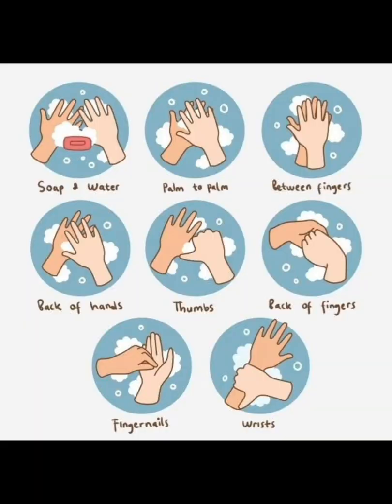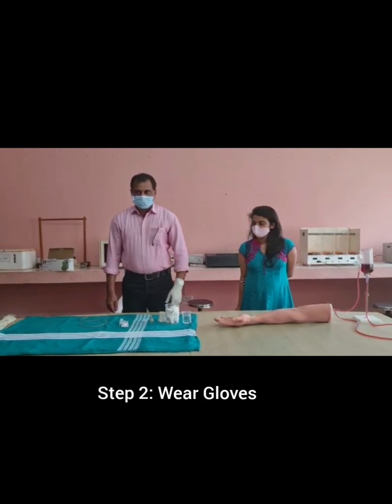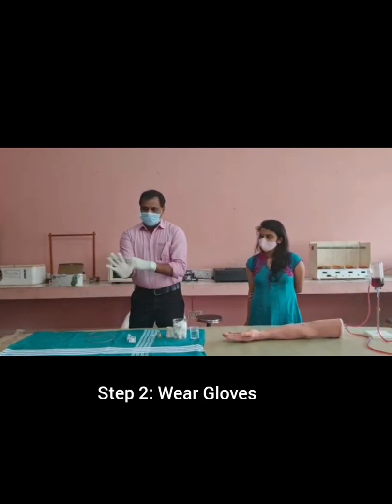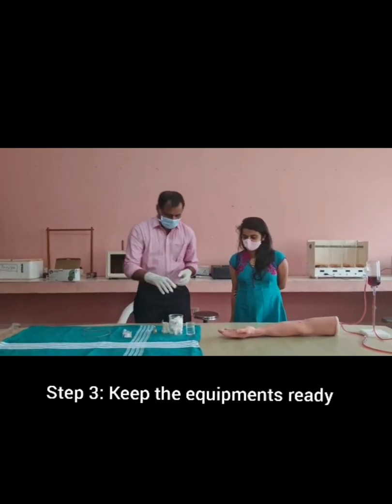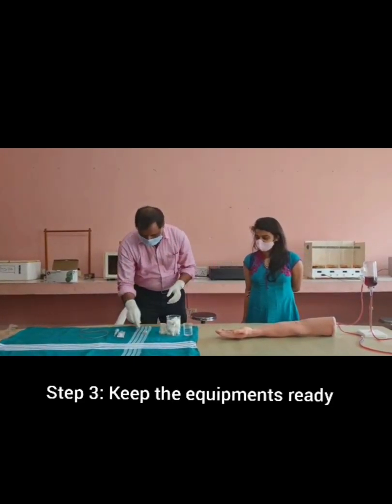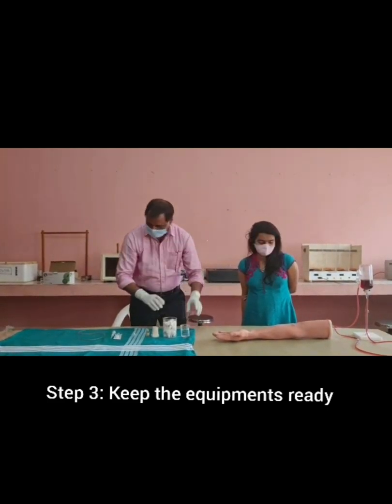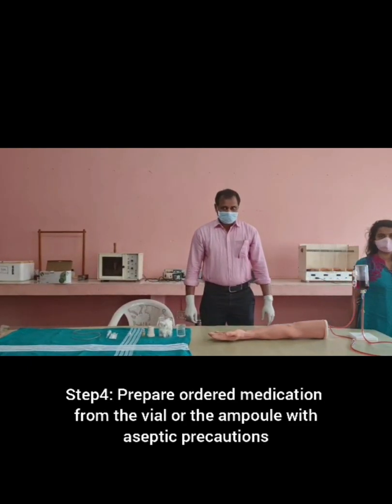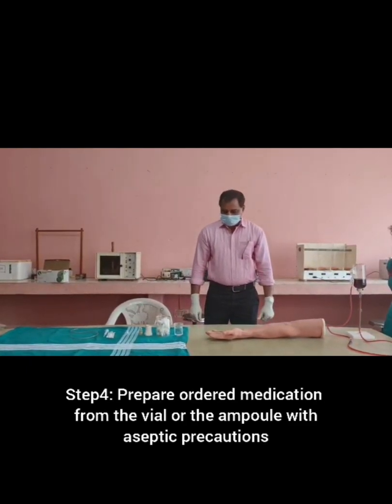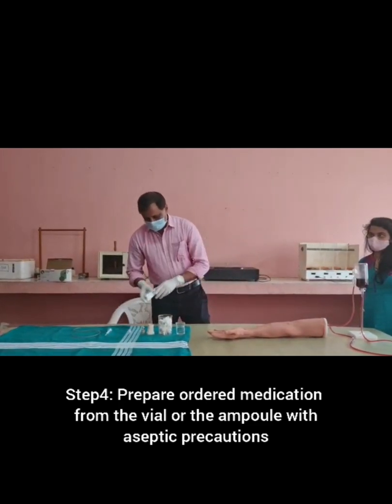Wash your hands and wear gloves. Keep the equipments ready. Prepare ordered medication from the ampule or the vial with aseptic precautions.